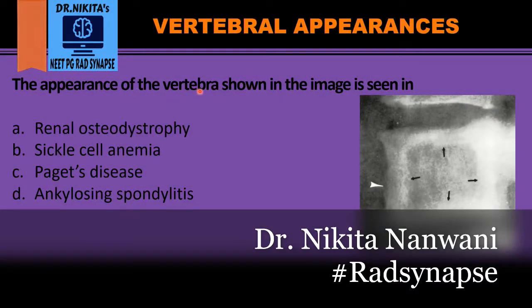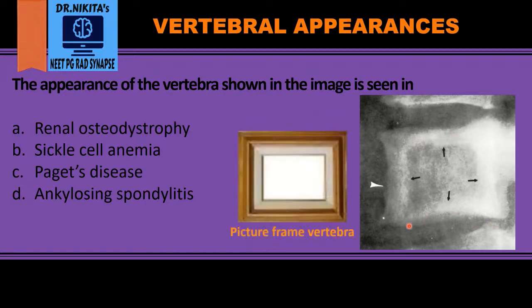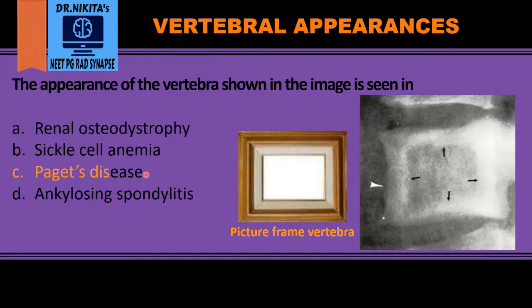We have to identify the appearance of the vertebra in this image. The appearance here is that of a picture frame vertebra, because we see cortical thickening all around the vertebra, which forms the picture frame, with the central area like a photograph within it. Cortical thickening is a feature of Paget's disease, which is why we see this picture frame vertebra in Paget's disease.